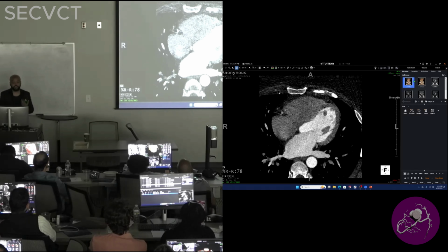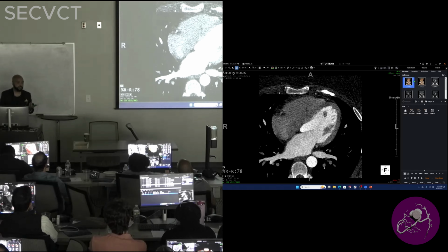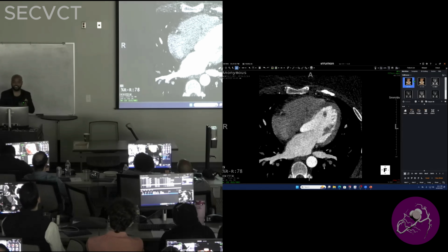And then also emphasizing what? Pre-medication beforehand. We want these coronaries to be what? Dilated before. As we were talking about before, what's going to be our dosage for sublingual nitro? Okay, and what else are we going to give them beforehand? All right, what's the ideal heart rate we want? 50. I've never hit 50. One day. But if I can get them about 60 to 70, that's ideal.